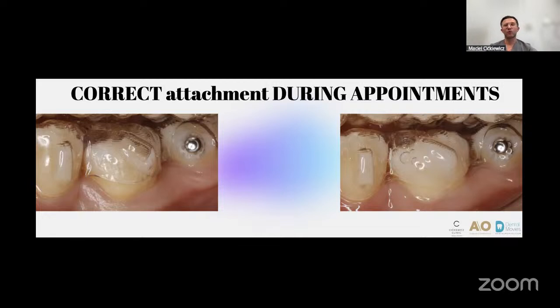And then we make a leverage on this tool, and we save our time for the next weeks, for the next months. So if the other elements of the aligners are working very well and fitting very well in the other regions, it is good to go with that.